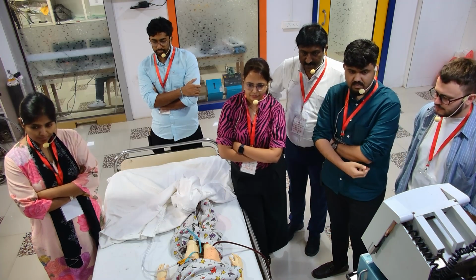Sudden. It was absolutely sudden. So if it is absolutely sudden, then it is more likely to be mechanical, a kink outside the circuit. It can be a clot in the venous cannula also, but in that scenario, probably you could have seen some chattering. So that is the way you differentiate. That is the way your mind should go.